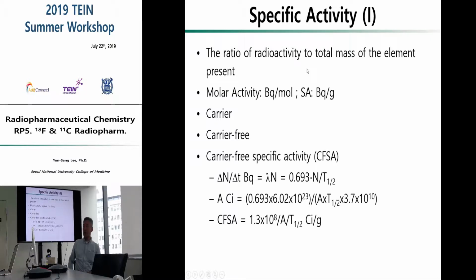We can make an image even with less than 1% C11 raclopride.